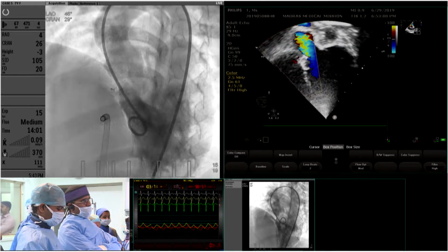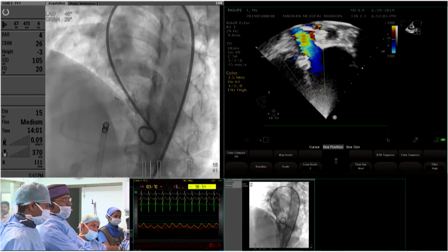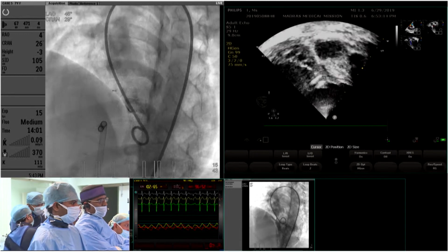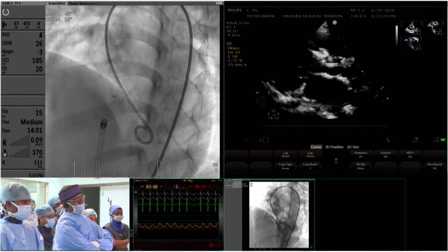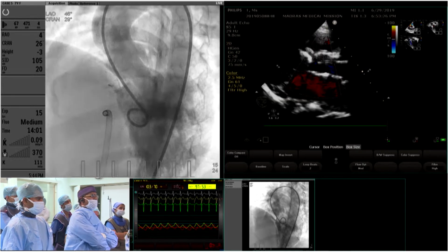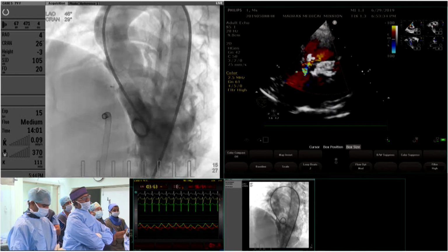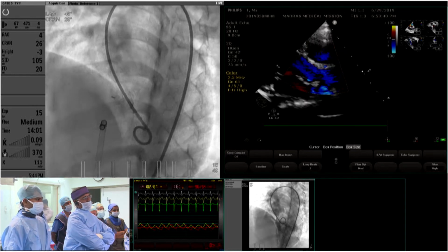The echocardiogram shows there is no AR at all. Tricuspid valve? Tricuspid, there is a trivial leak. However, that doesn't seem very significant. Yeah. When you mentioned that more study needs to be done, do you mean EP study or just monitoring? What would you do? No, periodic ECG monitoring of a patient. And that's what I thought. Okay. I thought you were making AV node blockage because of the SVT you had earlier. There is some flow on the superior edge of the device, right? Mm. But I hope it should settle out possibly with time.